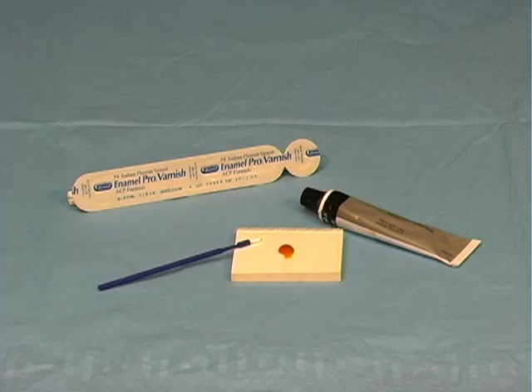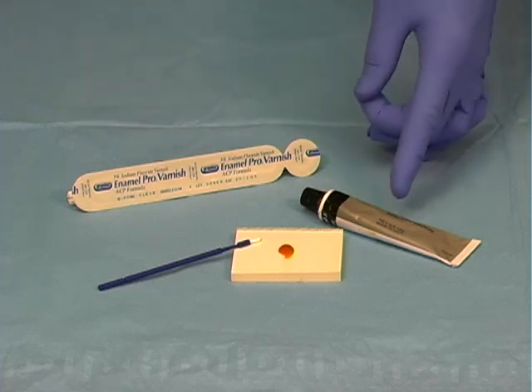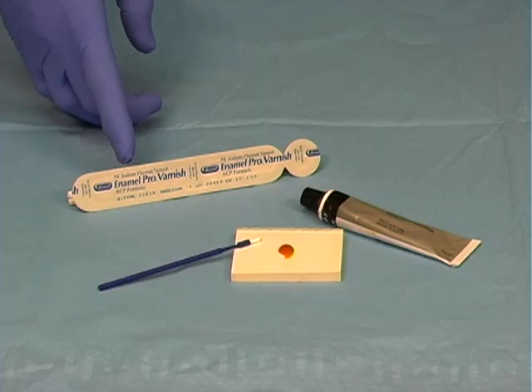This video will demonstrate the application of fluoride varnish. There are a variety of techniques to choose from, including a single unit dose packet available in a pre-measured well, and a varnish tube that is dispensed on a pad. For the purpose of this video, the single dose application will be demonstrated.